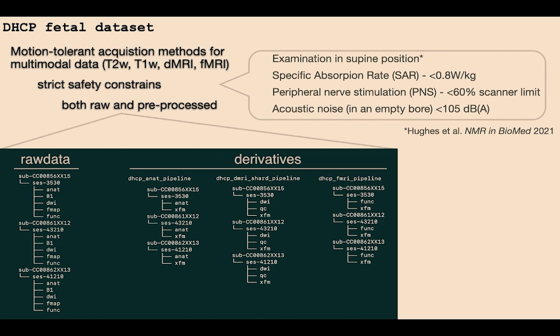In our release, we mirrored the BIDS formatting, even though the data itself doesn't fit this format well, but by providing the data in this format and using similar conventions, we thought we could make the life of users easier so they can recognize familiar structures in the data.